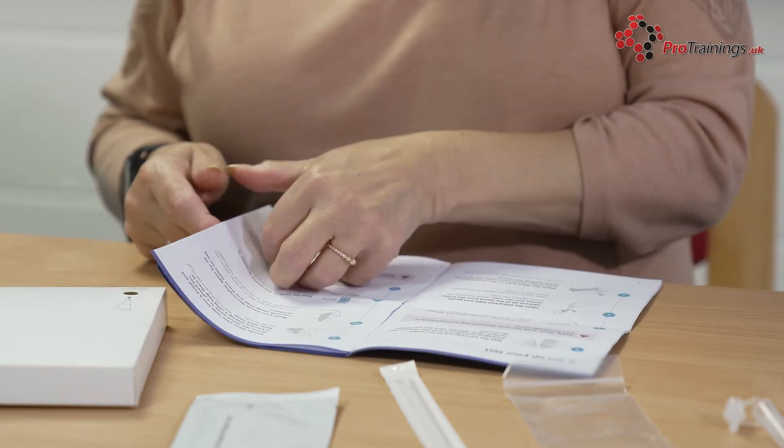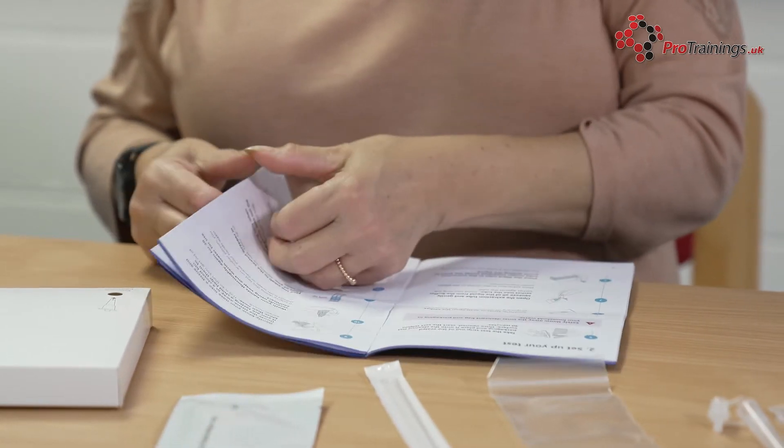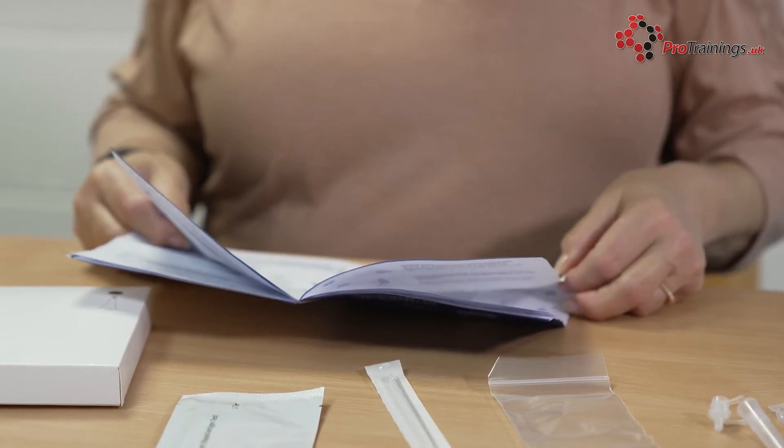If for any reason you cannot take the throat swab — for example, if you have a tracheostomy — swab both nostrils.